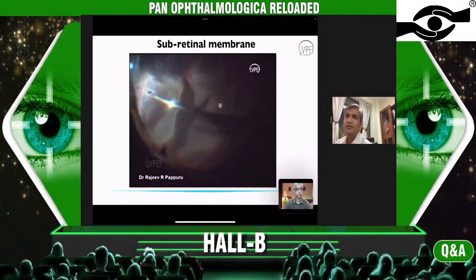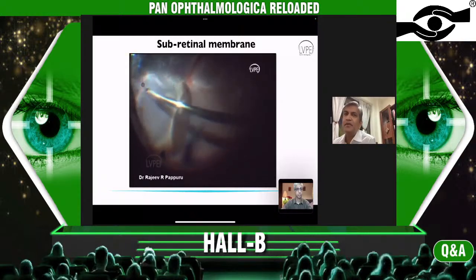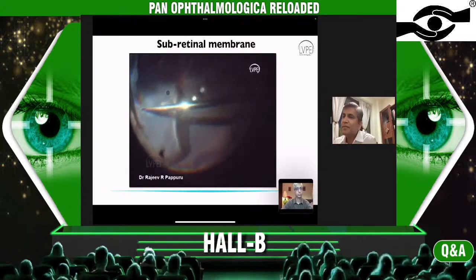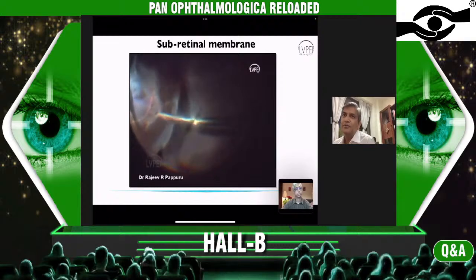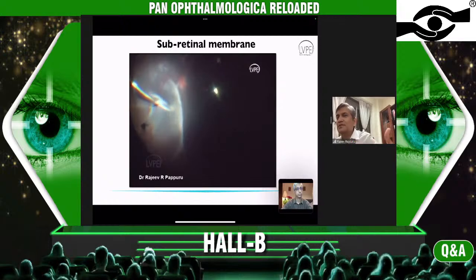So that's what is shown in this video. So I made a retinotomy there and the left side where the membrane was seen there, which is causing the retina to be stiff there. So that's what we identified, and we have removed all the pre-retinal membranes. I was trying to peel from the opposite side, so I was finding it difficult to hold. So I went from the same sclerotomy. So that's what actually gives you better access to that membrane.